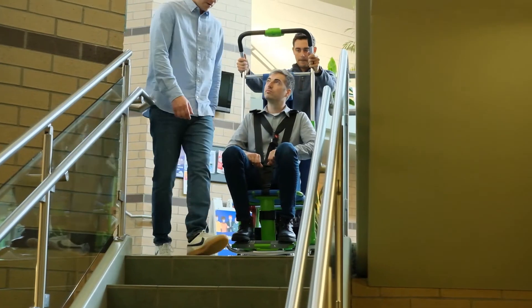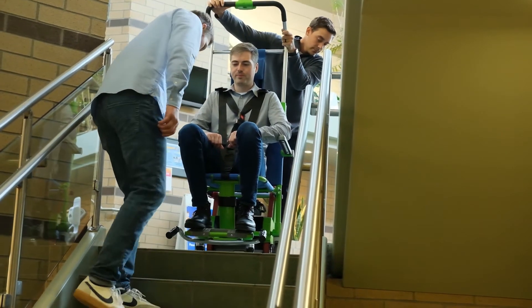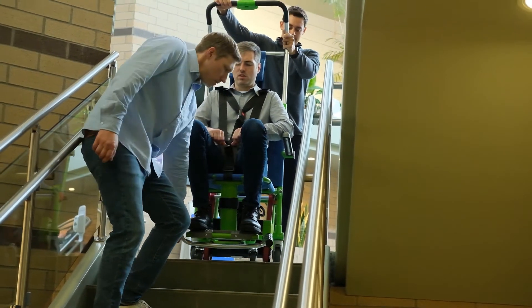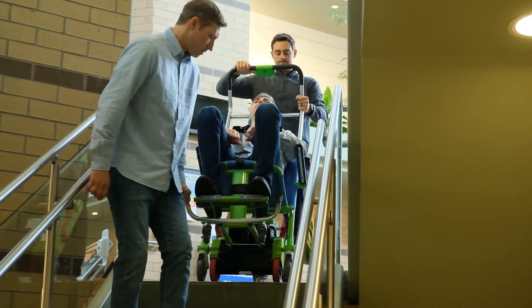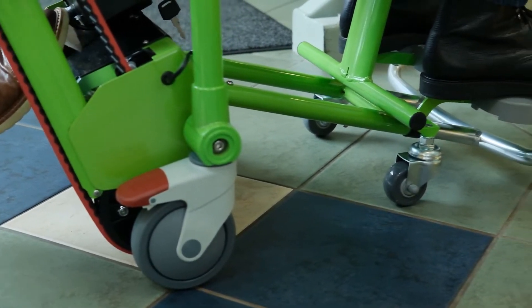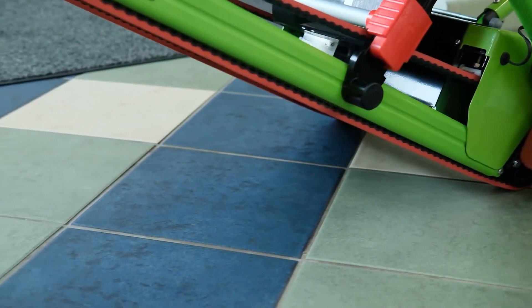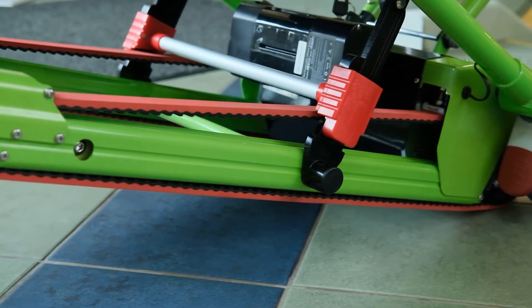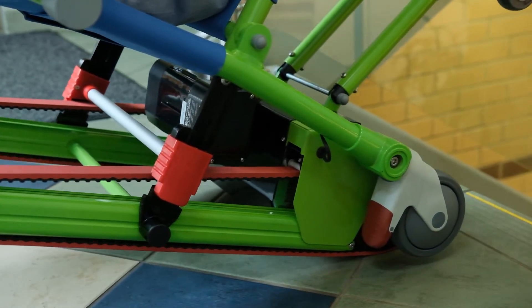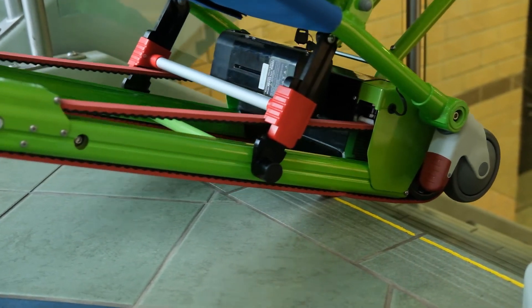To descend a flight of stairs using the XLE powered chair, first move the chair to the top of the stairwell with your hands in the pushing position on the outsides of the handle. Switch your hands from the pushing position to the top of the handle and place your foot on the green track assembly bar to lever the chair back. Make sure you don't lever the chair too far back or the gliding tracks will catch on the floor. Maneuver the chair forward until the wheels roll over the first step and the track makes contact with the stair edge.